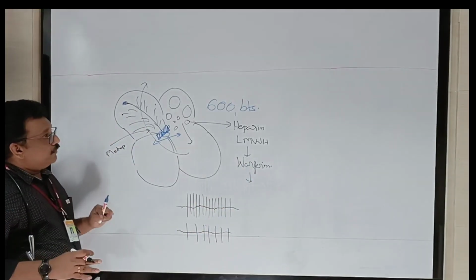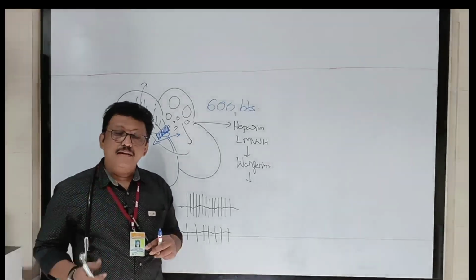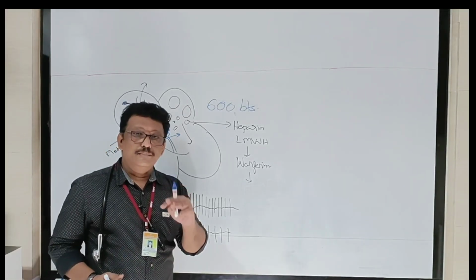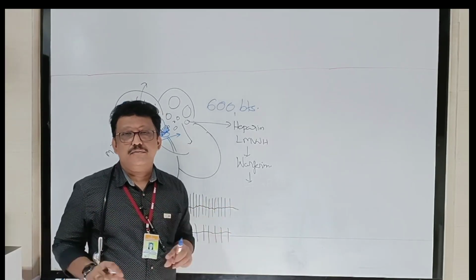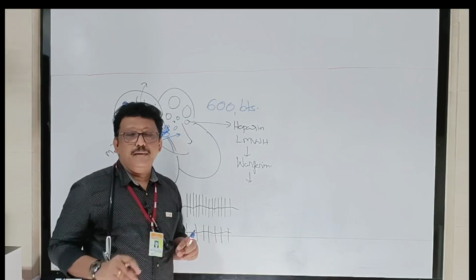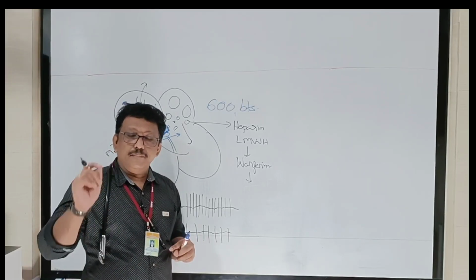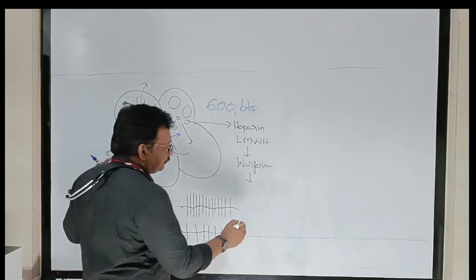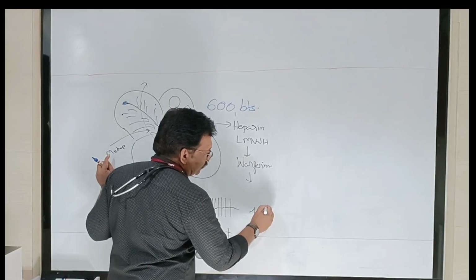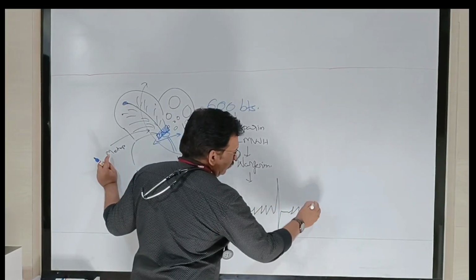So these are the two important problems in atrial fibrillation. We have discussed what abnormalities in the P wave you can observe in the ECG. You have to see the rhythm strip in the lower part of the ECG, then see what abnormalities are there, whether it is a single complex, multiple complexes, or totally irregular. Sometimes you can see a sawtooth appearance of the P wave, then more regular QRS complexes come.